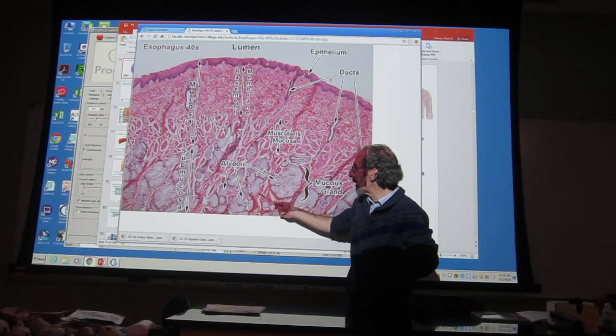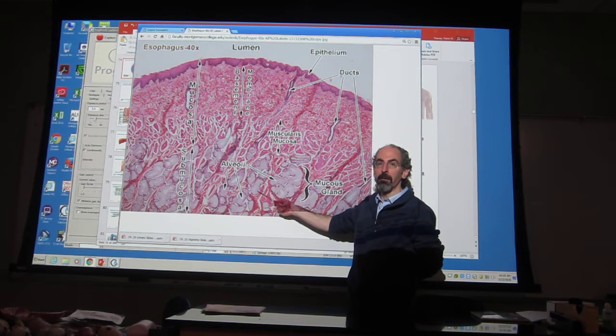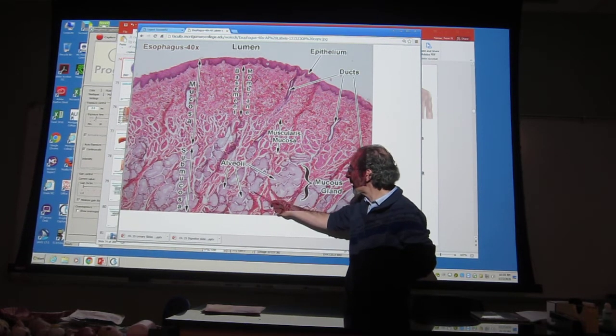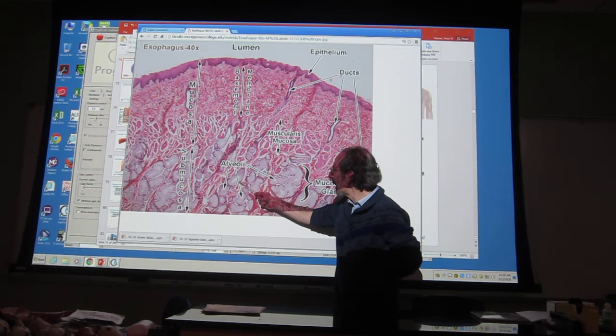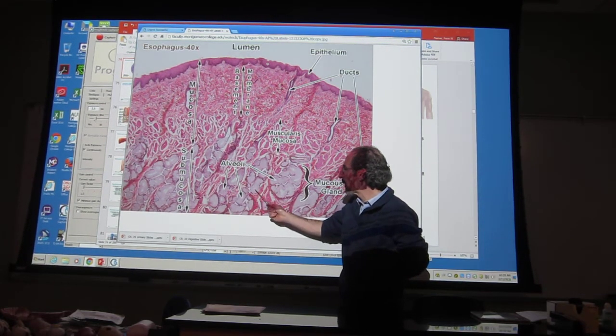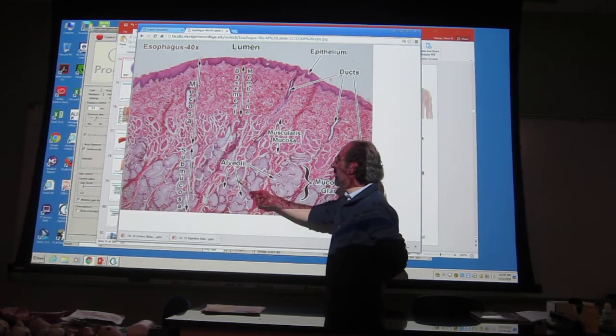They sort of form a ring-like shape, and it's a layer of simple, it's glandular tissue, so it's simple. Remember what epithelium glandular tissue is made up of? That's right, simple cuboidal epithelium. And you can see them here, and a ring of them here. And what happens is they secrete their product into a lumen, right there and right there. Where does that product go? It goes up to the surface.